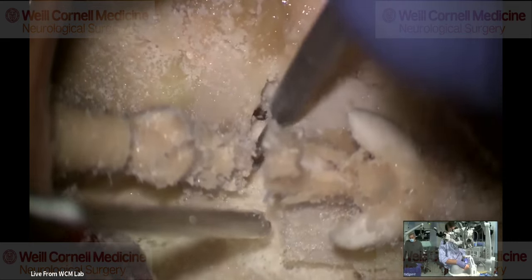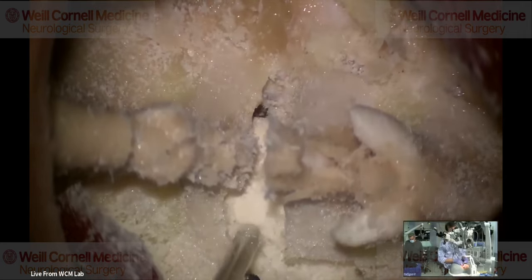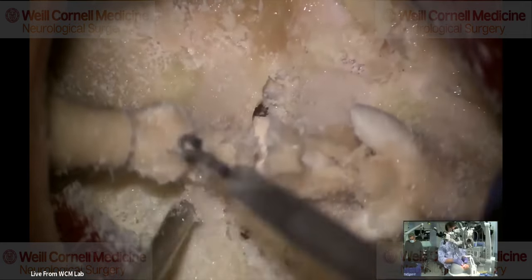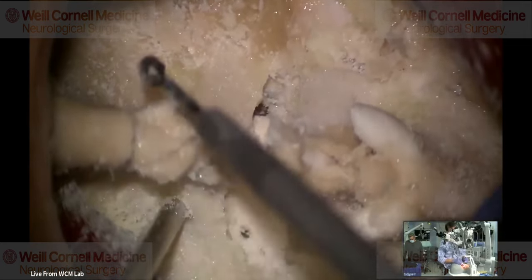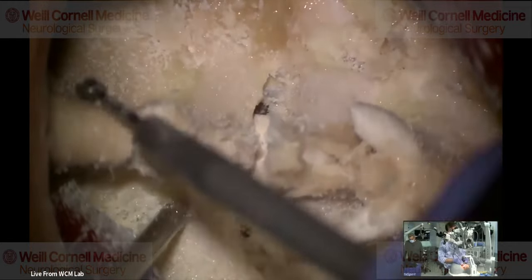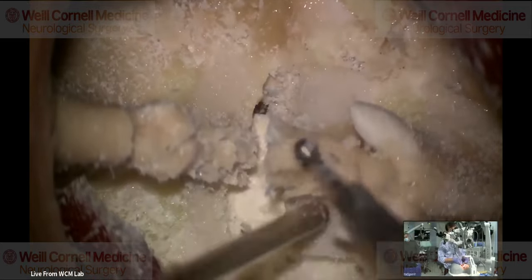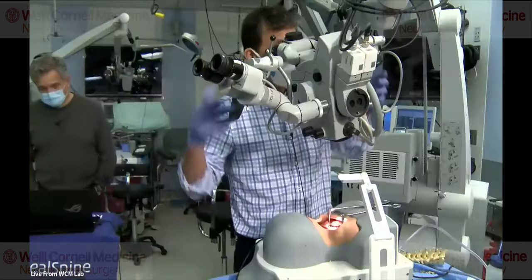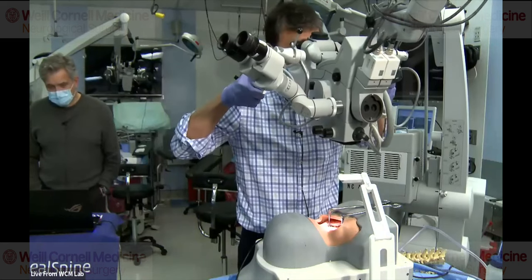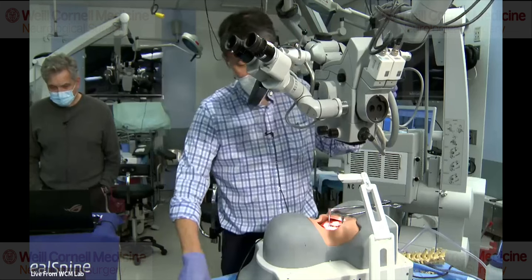So, all right. I've undercut over here, leaving the dorsal aspect intact. So your nuchal ligament would start, let's say this is C7 starting here and going up. It's the continuation of the supraspinous ligament. There is no such thing as an interspinous ligament. It's only the interspinalis muscle. And we've cut the opposite side. So now we have to lift up.